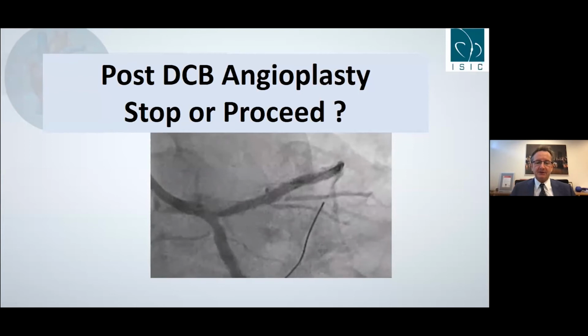And there are only two options. You go from left main to circ, as I initially suggested, and then do kissing with the ostial LAD, maybe with a larger balloon, and then again a drug-coated balloon as a last step for this proximal LAD, and then final POT.